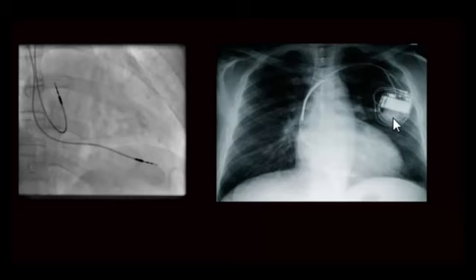Another situation where the pacemaker may be interfered with is during surgery, when they use electric cautery in and around the area. When that is the case, we generally either turn off the pacemaker temporarily during the procedure or try to use other means of performing the surgery without interrupting the rhythm, in case the patient is completely dependent on the pacemaker. When patients have pacemakers, they are generally followed by the cardiologist every 3 to 6 months.